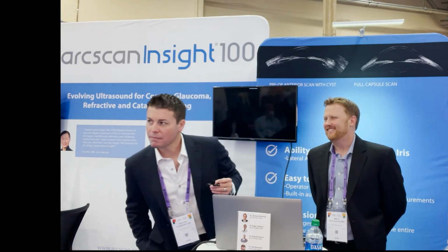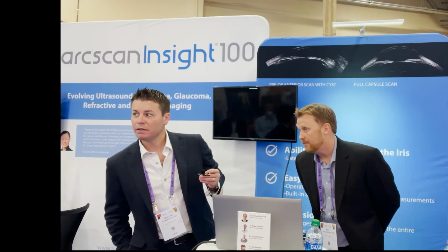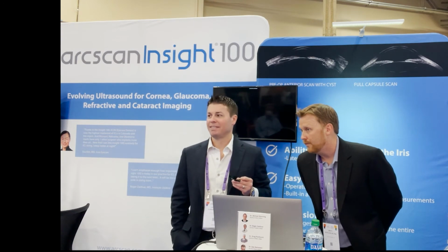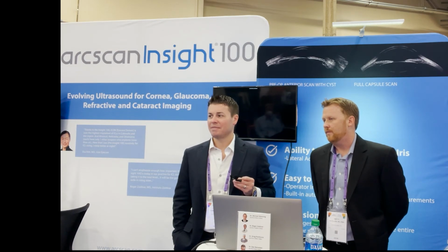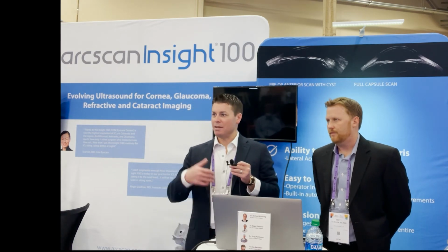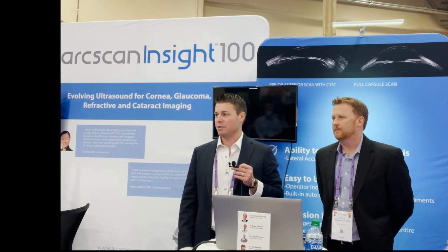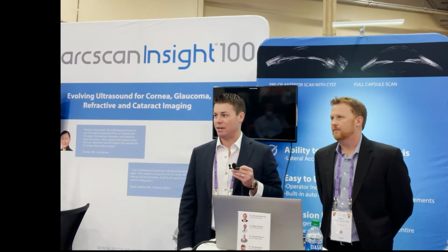Concern would be like data entry errors. Like what is your process just to make sure, double check, triple check, that the data that you are measuring manually here is actually entered correctly into the calculator? Totally understand the question, right? So with any refractive surgery we do, it's ultimately the responsibility of the surgeon to ensure that there's been a quality control process, that there was not a data entry error.